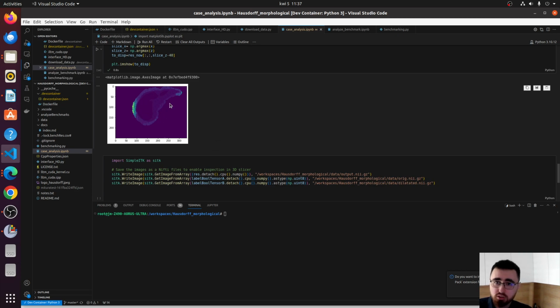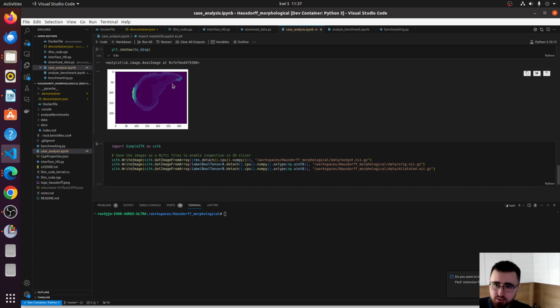The other problem that is also very clearly seen in such cases is that we never have an ideal segmentation mask created by the radiologist. It is basically impossible to do it perfectly because where the organ ends or starts is not always so clear cut, at least not in all of the places. Hence, some small changes from the gold standard to the algorithm output, if they are very close to the gold standard mask, are not so important. However, this is still just a 2D representation of a 3D object, and we cannot see exactly why here and here is the biggest problem.